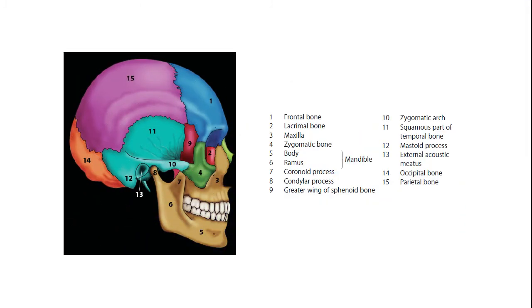When it comes to cephalometric analysis, a little learning is a dangerous thing. Clinicians must appreciate the geometrical relationships which constitute each aspect of cephalometric analysis, and not fall into the trap of attempting to treat cephalometric norms. Without such a thorough understanding, it is easy to misdiagnose, thereby leading to incorrect treatment planning.